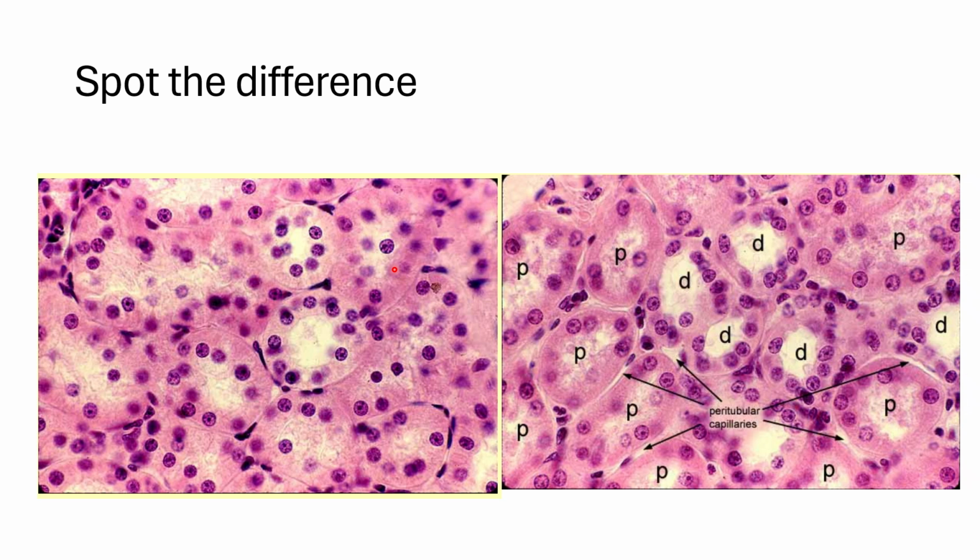This is because the proximal tubule is lined by simple cuboidal epithelium whose cells have several characteristic features, like the apical end of each proximal tubule cell has a brush border of microvilli. So this provides increased surface area to accommodate the membrane channels that are responsible for absorbing the small molecules from the filtrate in the tubular lumen.